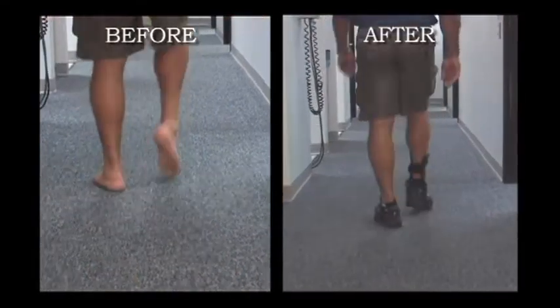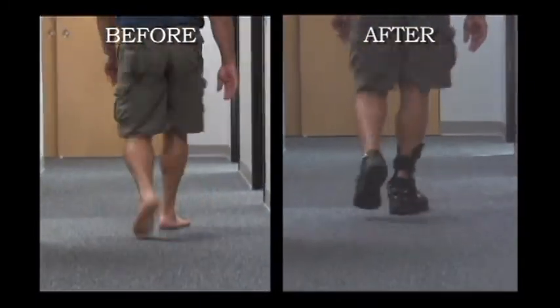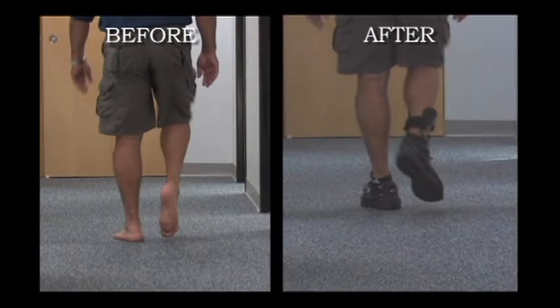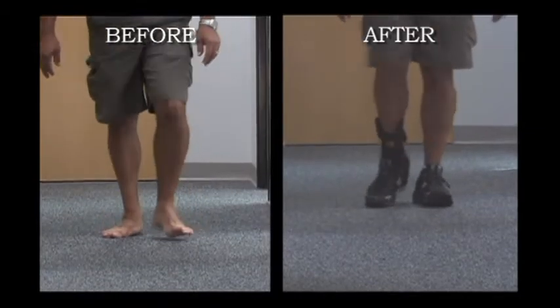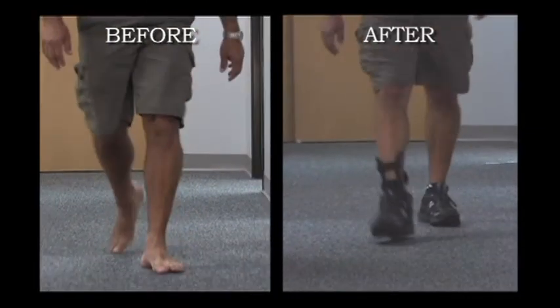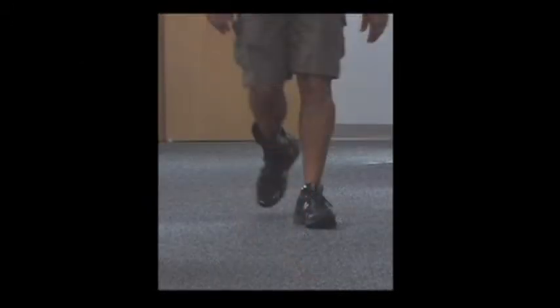Here is the same patient with drop foot deformity walking with and without the Richie Dynamic Assist Brace. It is clear the brace has the ability to control the drop foot deformity at the ankle, but also addresses the compensation which is seen at the knee level.